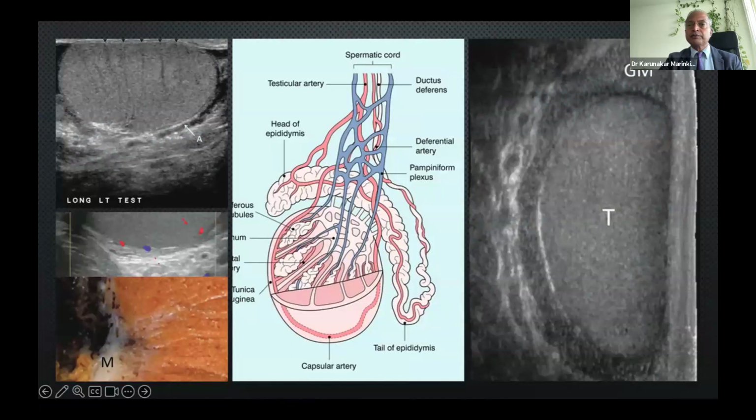Now, in this one-stop fertility assessment, I want to get simple male assessment out of the way. If you scan 10 ultrasounds of the scrotal sacs of your own staff today itself, or tomorrow, whenever you have access, with a linear probe or a curvilinear probe, when you see 10 normal men who are fertile, you know how the testis looks. You're actually taking the organ into your hand, and then you're just scanning by touching. It's much easier to scan testis, and you can always see the veins around the spermatic cord. And with the hand, you should be able to feel the vas. So any of you can easily acquire how to see the testis, normal, abnormal, normal location, and the veins. So male assessment in the one-stop fertility assessment is quite straightforward. And obviously, that's part of the one-stop fertility assessment service.